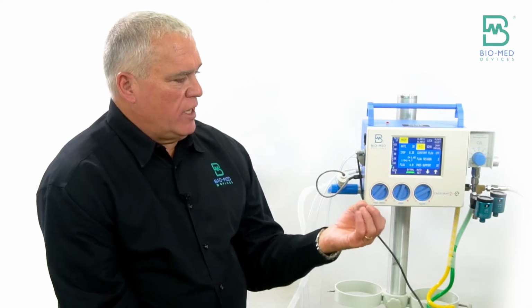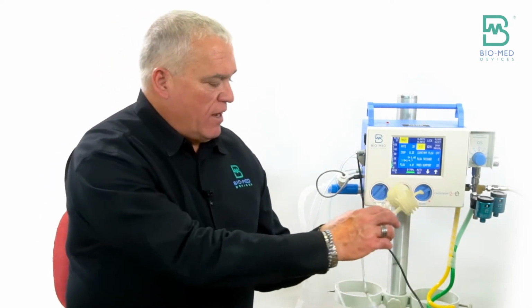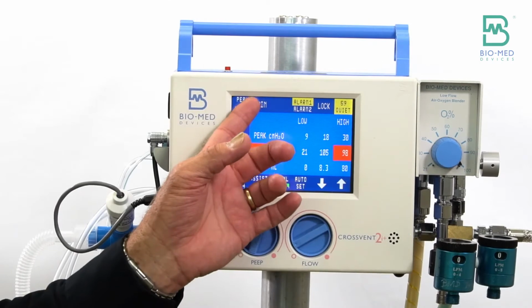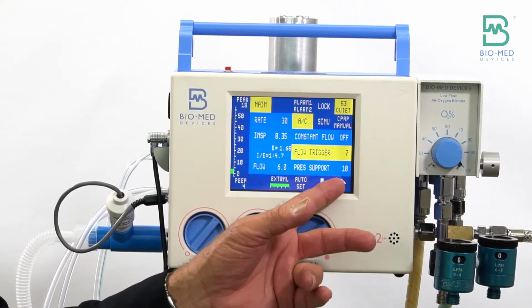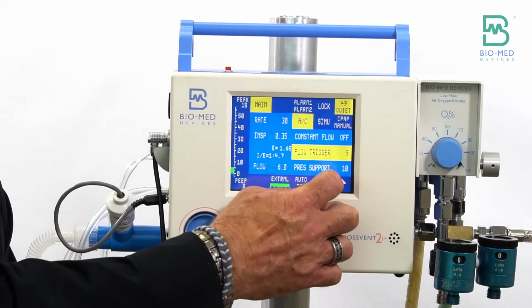Everybody wants to know where to set the flow triggering. There's no real magic number. You want to set it as low as possible, but it really depends on how much leak there is. If I actually have a leak, you can see, alarm quiet. I need to raise that sensitivity till it's not auto cycling.